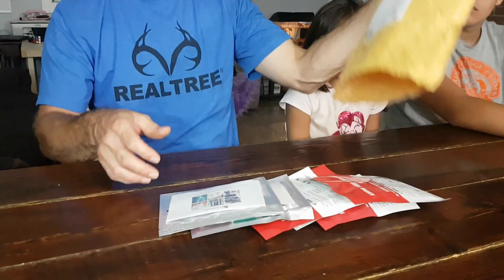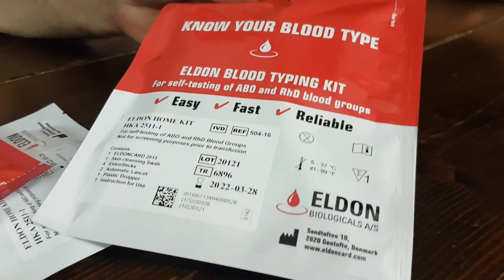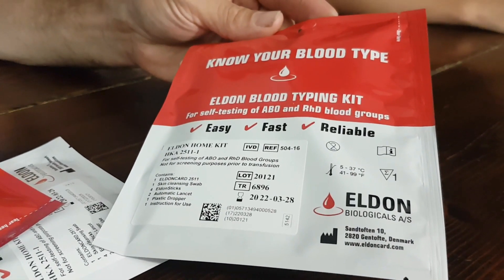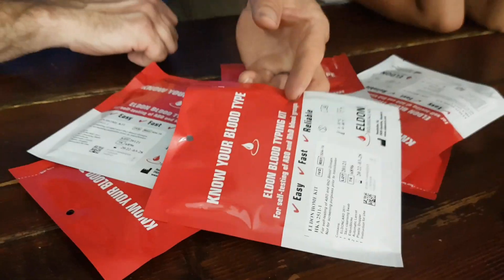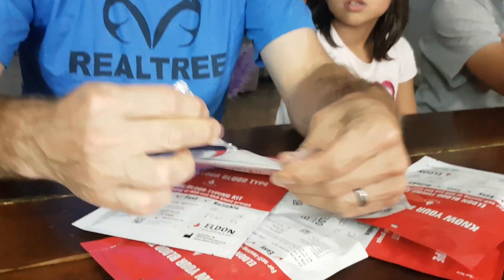We tried to find the kids' blood types on their birth certificates or passports, because hospitals will often test that. But it doesn't seem to be on our kids' birth certificates, so we went on Amazon and ordered some home blood type tests. This is the test we have — nothing to do with this brand, we're not endorsing them, but this is what we got on Amazon. It's one of the cheapest but it had good reviews.